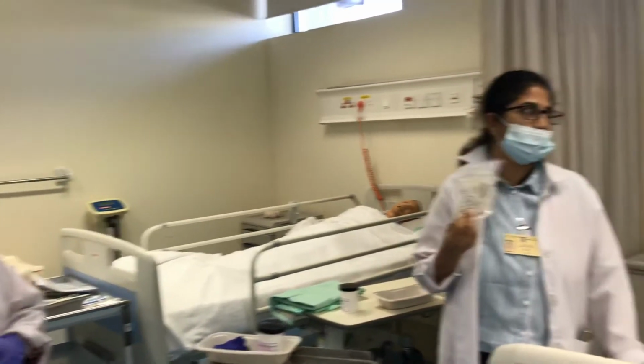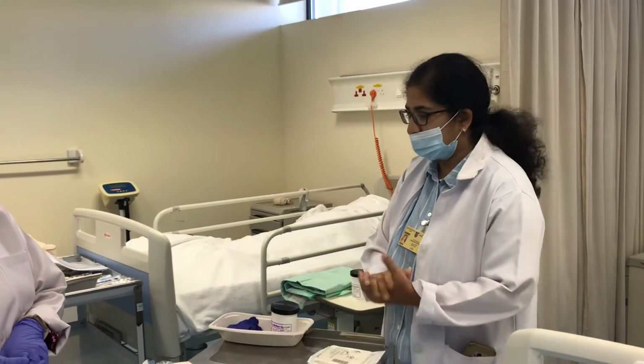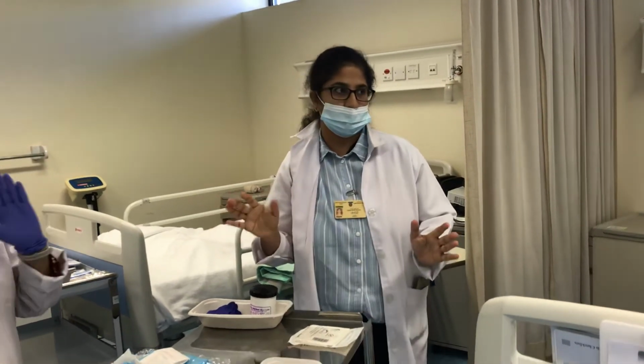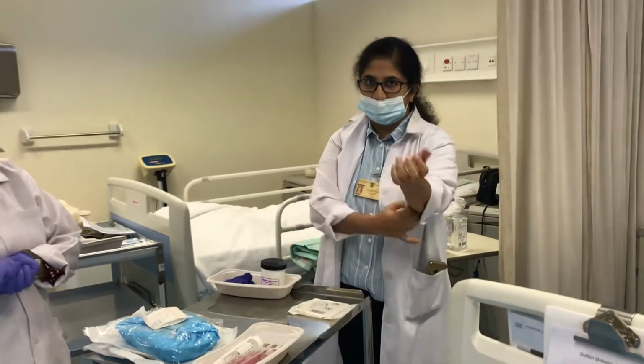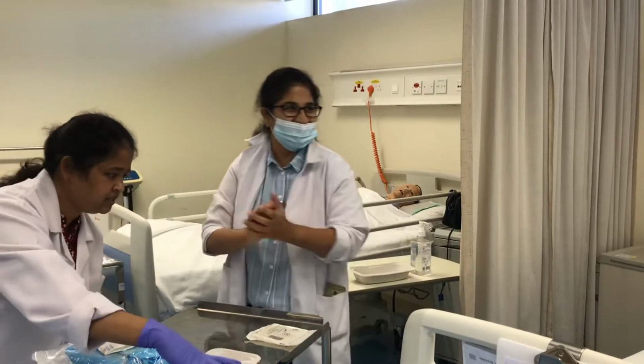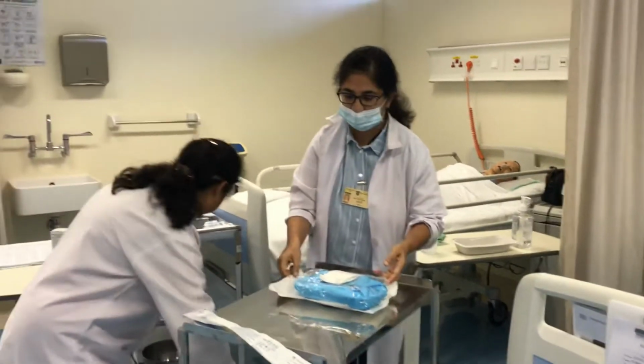Then we have the sterile gloves. So to start with, I need to wash my hands. I need to wash like a surgical dressing, surgical technique. Yeah, keep on like this. It's a little bit understood.